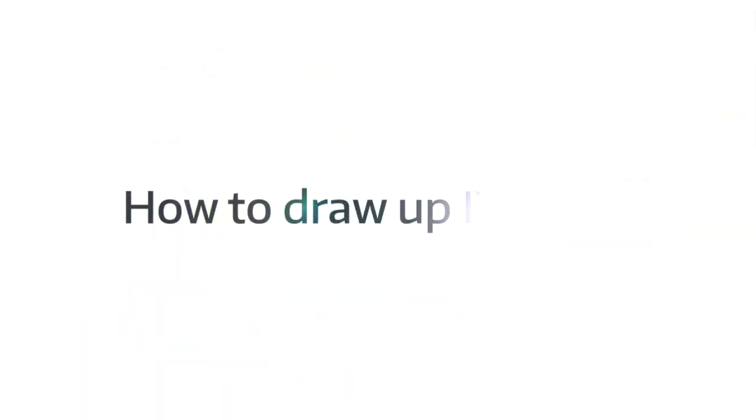One thing I found really tricky when I started as a novice anaesthetic trainee was learning how to draw up drugs. So I'm going to demonstrate it here just to make it easier.